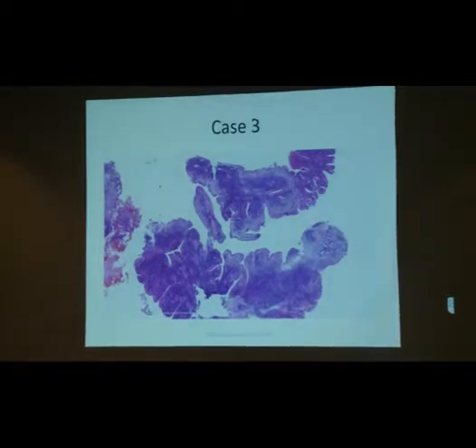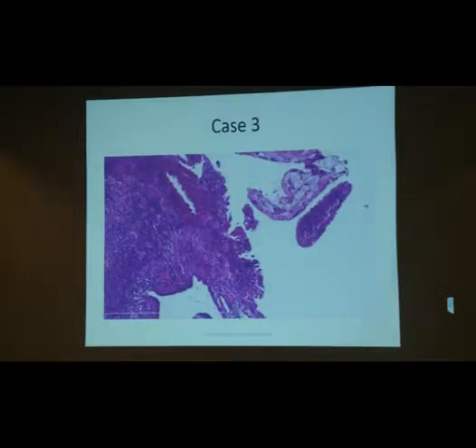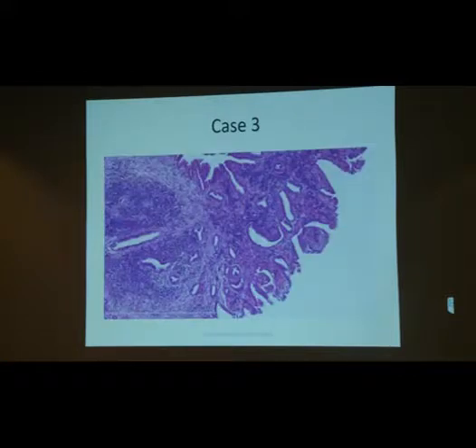You can see that the stroma is rather blue, and then you can see it's kind of polypoid. Here you can see again, bluish stroma. And here's the epithelium. So notice this epithelial lining, a little discohesive on the top. Some of the cells are falling off. Here are the glands. So you can see these glands within the stroma. They look a tiny bit blue as well.